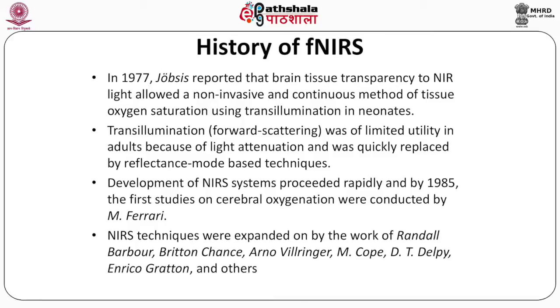This trans-illumination, in other words forward scattering, was of limited utility in adults. Since he studied it in neonates, later on it was found that this has very limited utility in adults because of light attenuation, and it was quickly replaced by reflectance mode based techniques. Development of NIRS systems proceeded rapidly, and by 1985 the first studies on cerebral oxygenation were conducted by M. Ferrari.